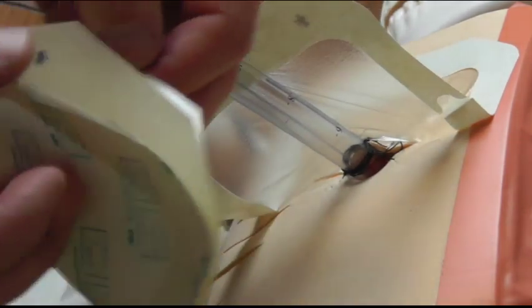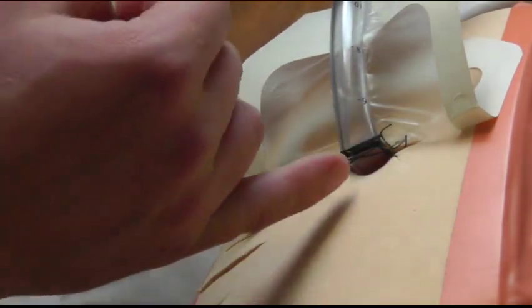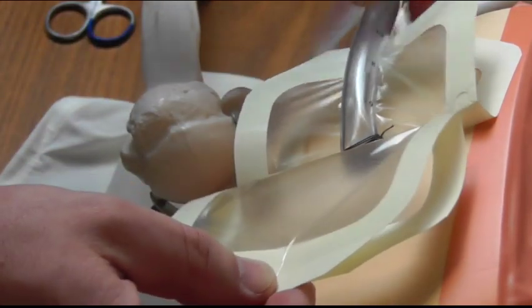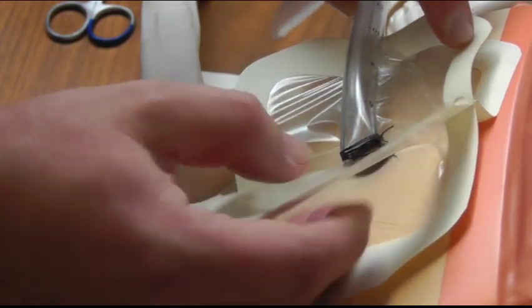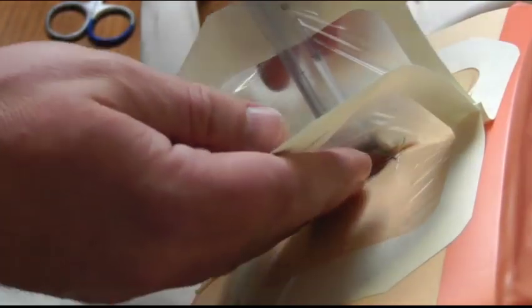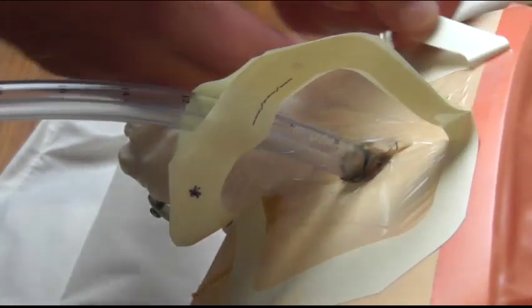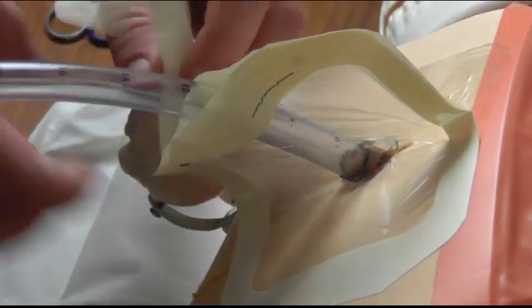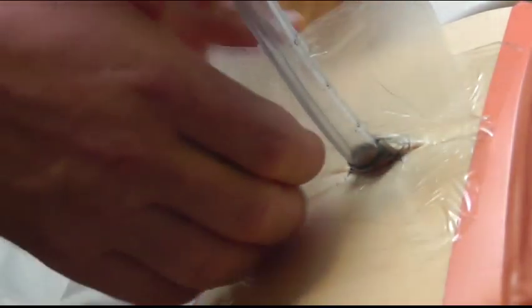Then you grab your other one, peel the backing off, have it like this. You fold the tube away and you go right in. I'm heading for that crease right down there and I want these ends of the tube of the dressing to touch right down there. I push it down on the skin first and then I just fold it back up like that and into a sandwich. You can see then the tube's enclosed in the dressing. You then just peel the backing off. A little bit fidgety but it comes off fairly easily. But there you go. You've then got a sandwich dressing.